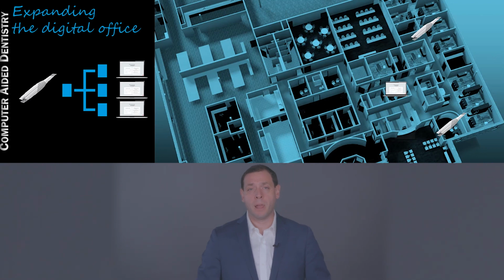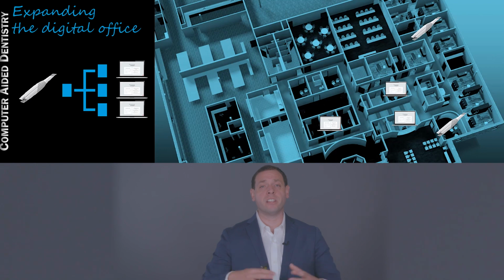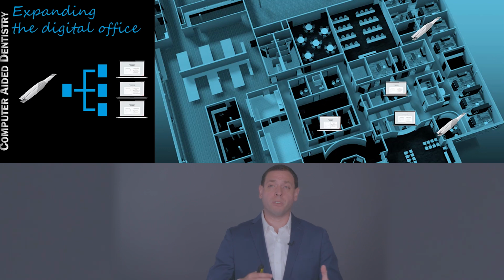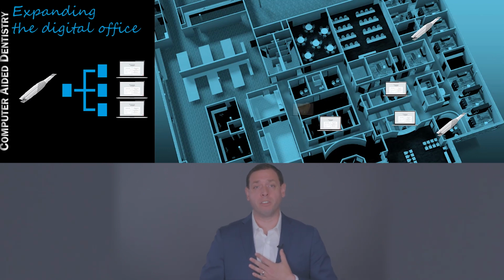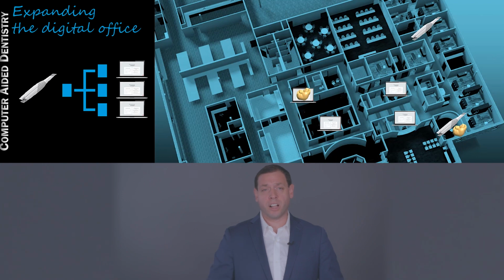So in a different consult room, we want to make sure that we can bring the scans up there. Our office manager also needs to be able to check that all the scans have been sent for the day to the corresponding treatment areas that they have to go to. Same thing with Dr. Barber. She prefers to view her scans in her office. I like to do same-day design for my patients, and I like to design those in my office. So sometimes I design in our consult room, and sometimes I send it off to the laboratory.